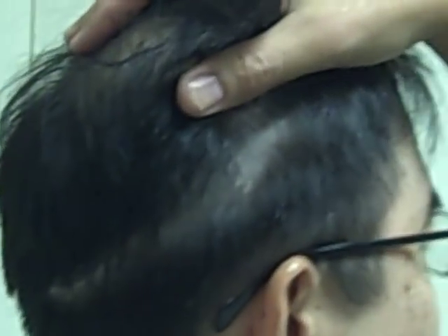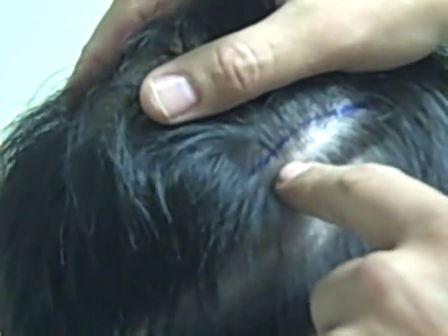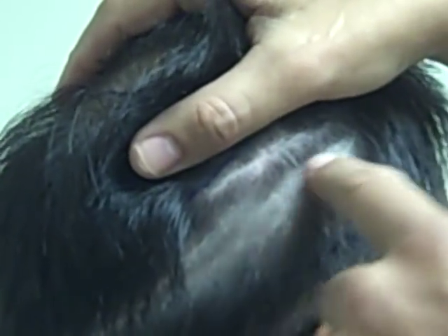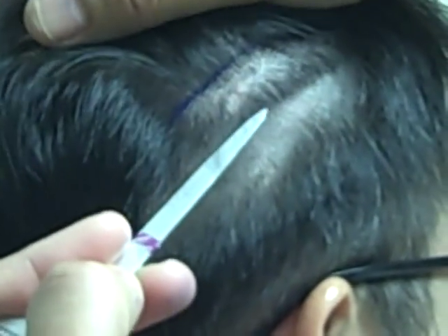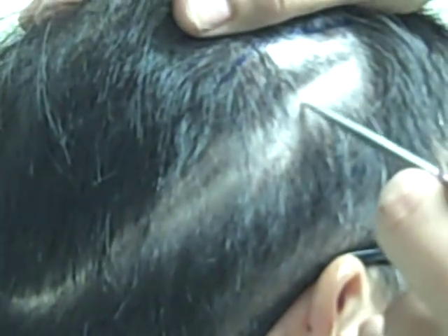Obviously, when we use the term Asian, it covers a wide variety of ethnic groups, but there's an overall tendency for Asians to have very coarse hair. The individual hairs tend to be thicker, and the spacing between the follicular units tends to be wider. So what you can see here is we have straighter hair, and I've already trimmed his hair. Now, he had a prior procedure. You can see the fine line scar from the other surgeon who did a nice job. You can see the spacing between the follicular units, but each follicular unit happens to be thicker.